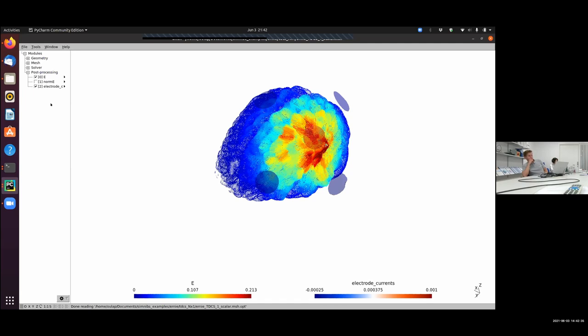Then we have an anonymous attendee who asks about importing the results from TMS Opt into neural navigation software. So this is something which we want to simplify in the future. Right now, I think the trick is to run the head models with headreco and not MRI to mesh. When you do it with headreco, it leaves all the spatial information of the T1 as it is, and also the output coordinates which TMS Opt gives are in the spatial coordinate system of the original T1.